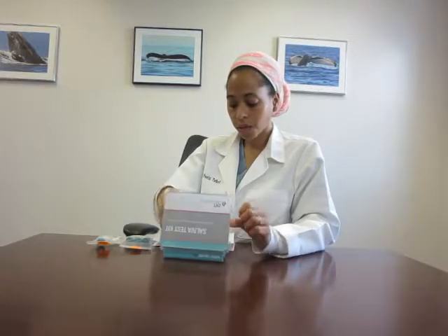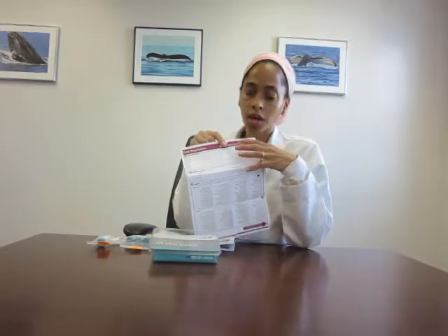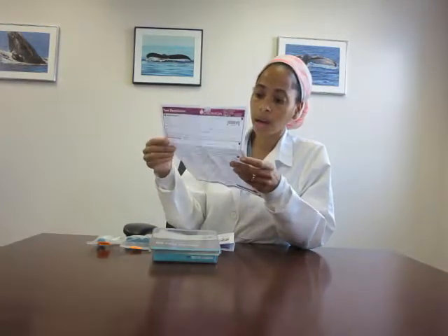With all of our test kits, it's really, really important to fill out the test requisition. So this form has some information where you just pretty much put in your name, address, and whether you're female or male. And then it has a questionnaire — it is really helpful to fill that out.